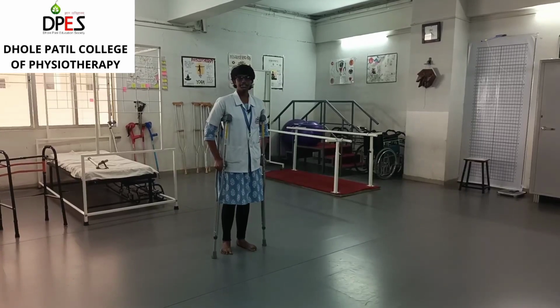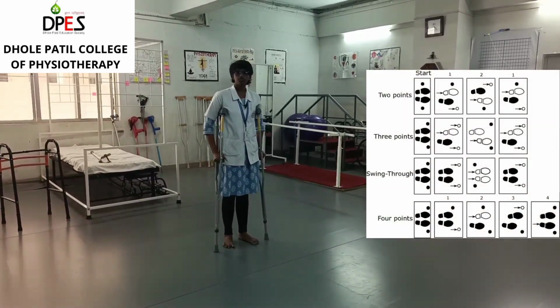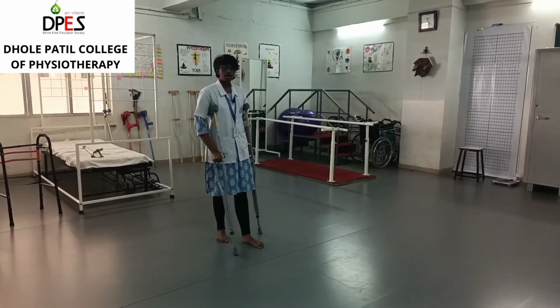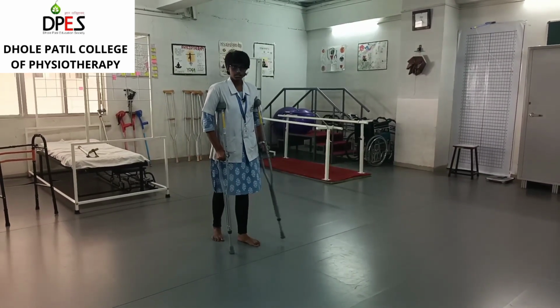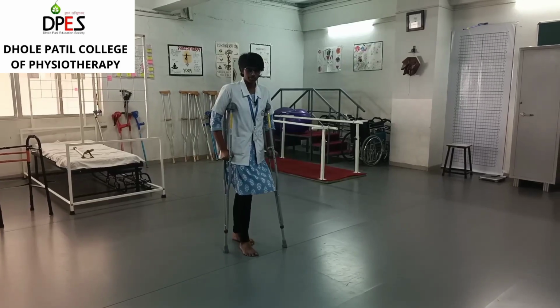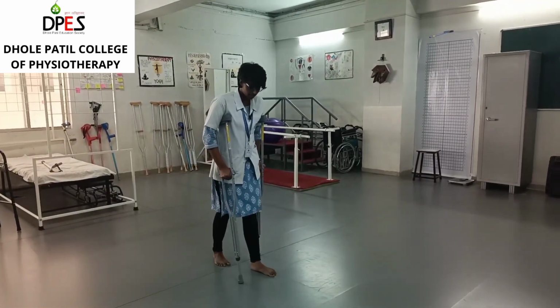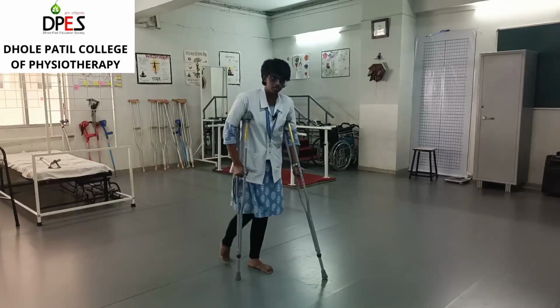Next one is 4-point gait. So in 4-point gait we usually put one crutch forward along with the opposite leg. After that it is followed by another crutch forward and the opposite leg forward. So my right crutch goes forward followed by left leg. My left crutch goes forward with right leg.